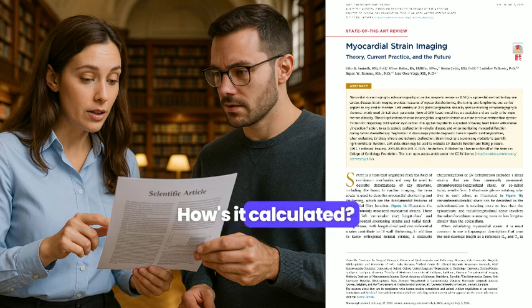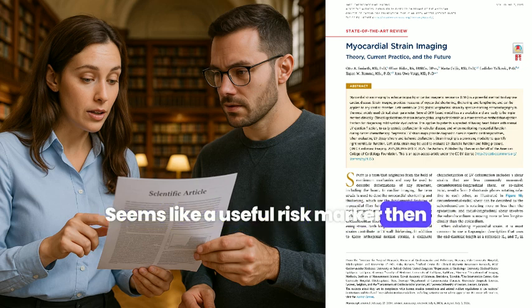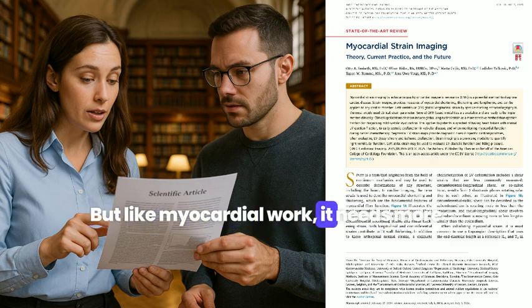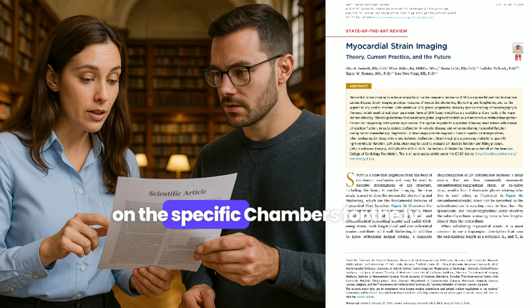How's it calculated? You look at the standard deviation of the time from the ECG Q wave or R wave to the peak shortening in each segment. Seems like a useful risk marker then. Potentially, yes. It's promising, but like myocardial work, it needs more validation in big prospective outcome trials before it becomes routine.